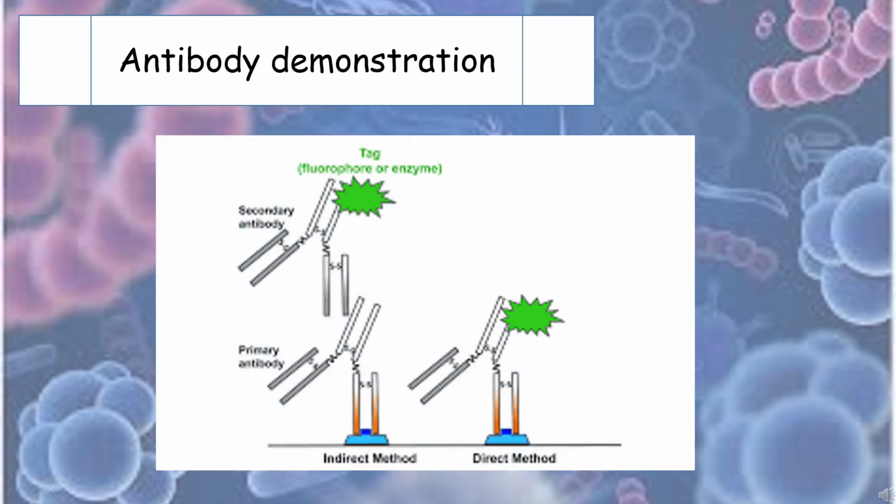Antibody demonstrations are techniques that show the presence of antibodies in cells or tissues. These techniques use immunological reactions and fluorescent labeling to identify antibodies.